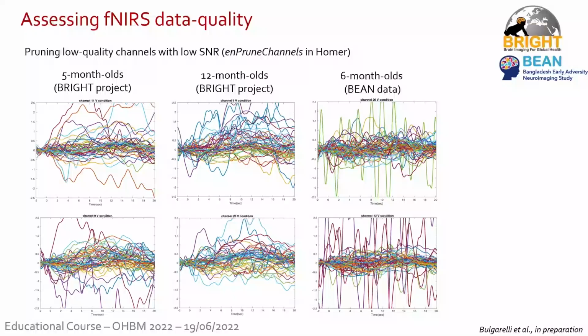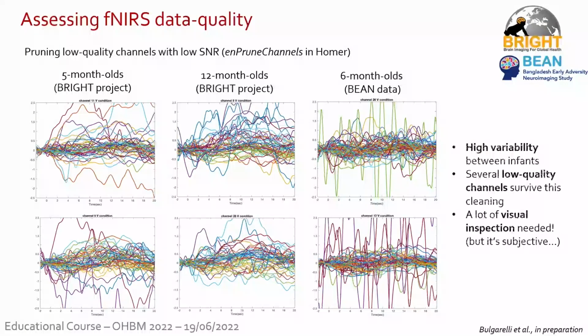The reason why I started to collaborate with him is because I was analyzing data out of my BRIGHT project, and what I was seeing was this. This was data at the very final stage. This should be an HRF. Every line is a baby. But as you see, even if you've never seen NIRS data, I wasn't really happy about that.